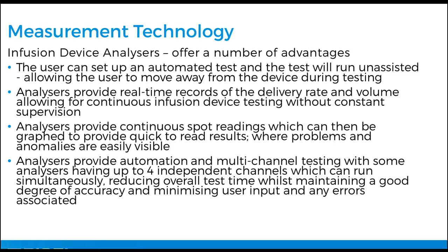Analyzers also provide this automated multi-channel testing solution. So you can have up to four independent channels to run four independent infusion devices. So this reduces the overall time. You kind of do that with one set of linear travel gauges and calipers. You need four members of staff to do that type of thing. So they have big benefits to reduce the overall testing time, whilst maintaining a good degree of accuracy and minimizing all of the input errors associated with other technologies.